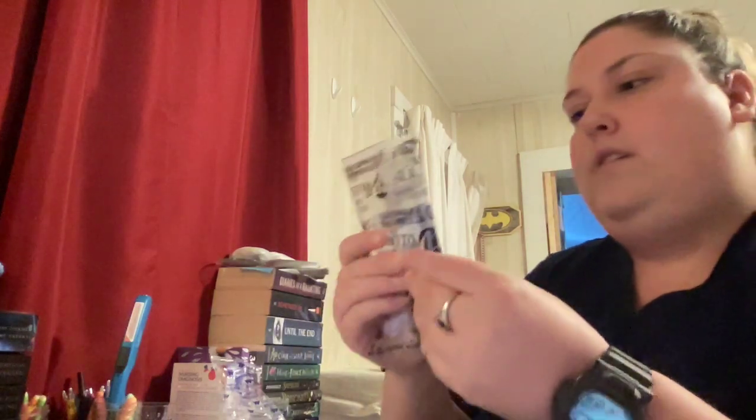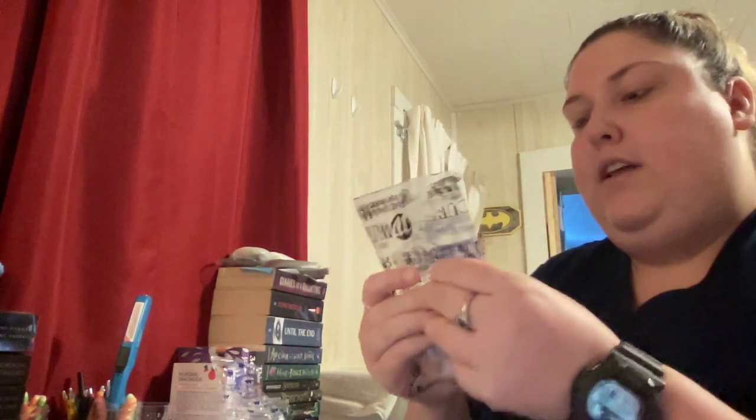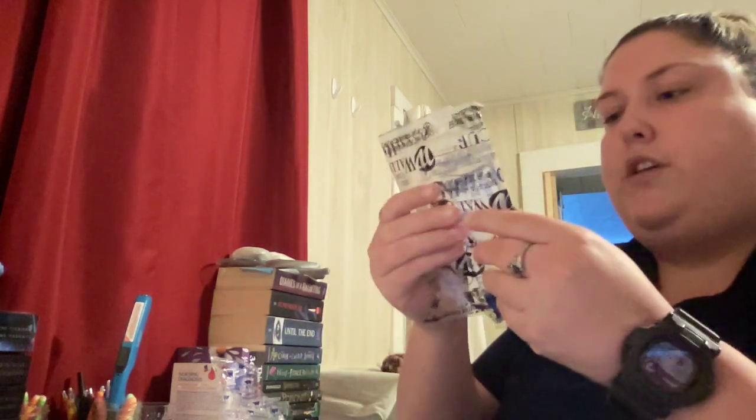I'm going to use my primary IV tubing with that. It's 15 drops per milliliter tubing, and my expiration date on that is good as well. Next, I have my cefazolin sodium, 1 gram in 50 milliliters normal saline. Compared to my MAR, cefazolin sodium, 1 gram in 50 milliliters normal saline, IV piggyback over 30 minutes. My expiration date is good on this, and my solution looks clear, nothing wonky there. I'm going to use a secondary tubing set with that, also 15 drops per milliliter tubing, and my expiration date is good.